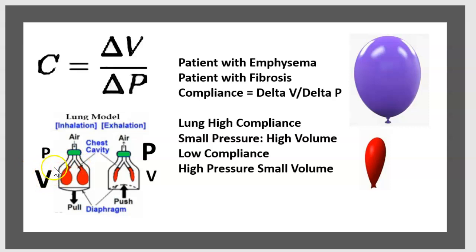The volume is high, the pressure is small, it gives high compliance. On the other hand, if high pressure and small volume, it gives low compliance.